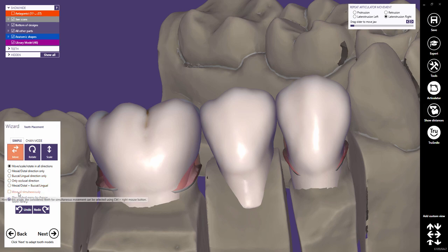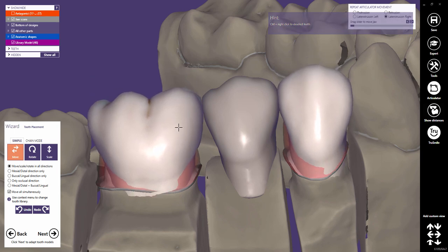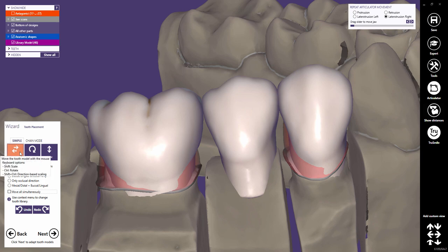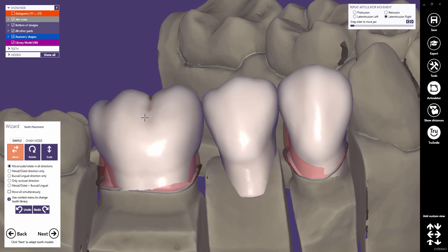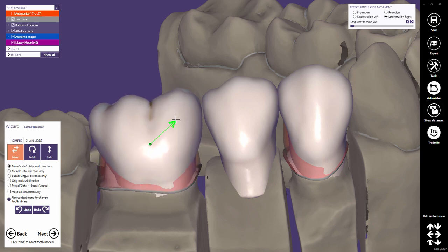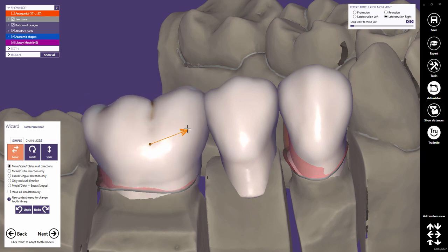If you want to move the whole tooth bow, click Move All simultaneously. With Ctrl and right mouse click, you can deselect teeth. Instead of using the mouse for switching between the transformation modes, I recommend using shortcuts to quickly toggle modes. To activate those shortcuts, check Move Scale Rotate in all directions. Hold only the left mouse button to move the tooth. Hold Ctrl and the left mouse button to rotate the tooth in all directions. Hold Shift and the left mouse button to scale the tooth, and Ctrl and Shift to perform direction-based scaling. Using shortcuts will save you a lot of time.